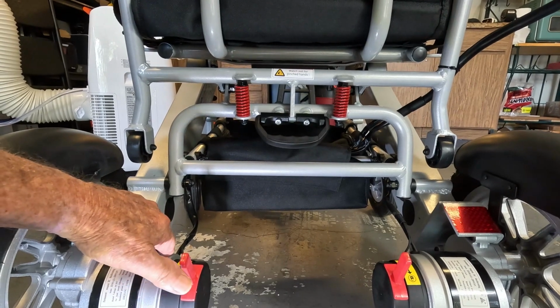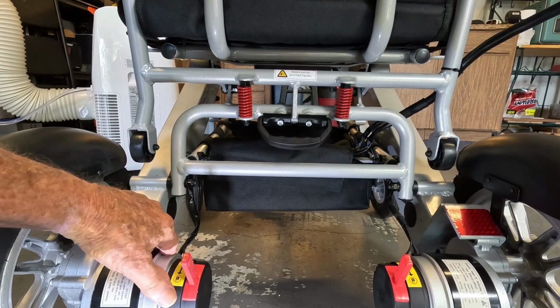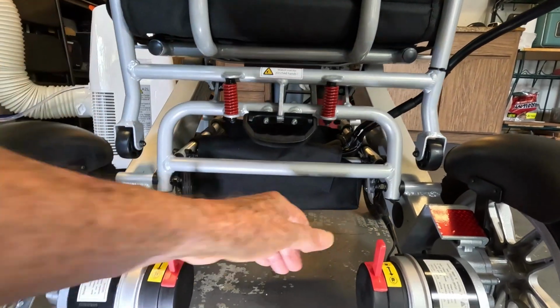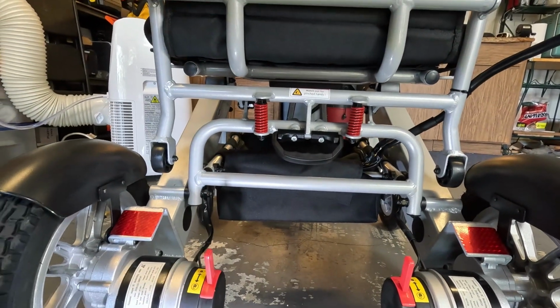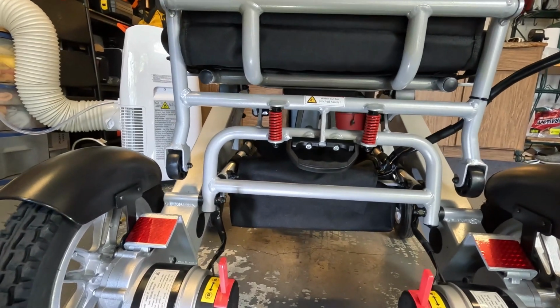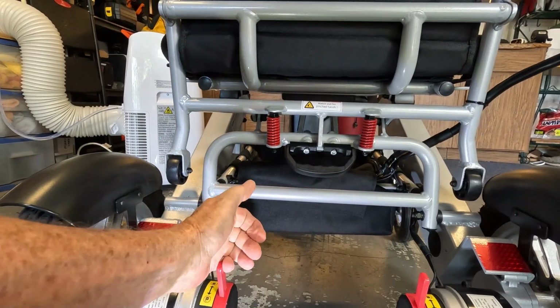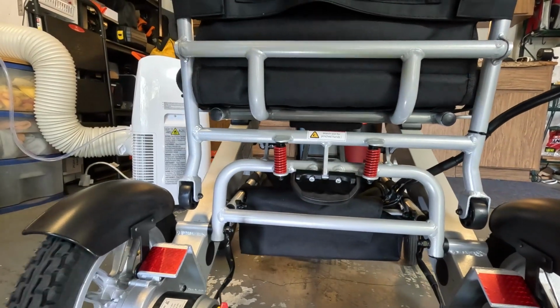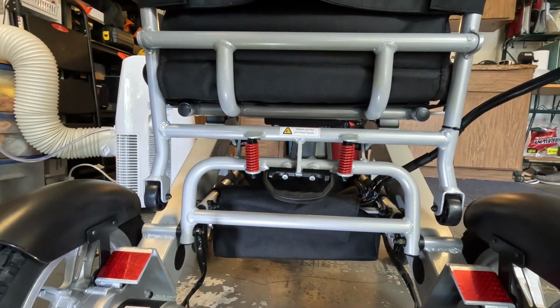Now when you get ready to use the chair, you push this one and this one to the drive. Once you do that, it's locked in position. You can't roll it. When you want to roll it like a wheelchair, you have it in this position, and now it can roll.